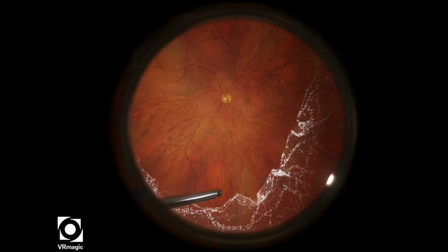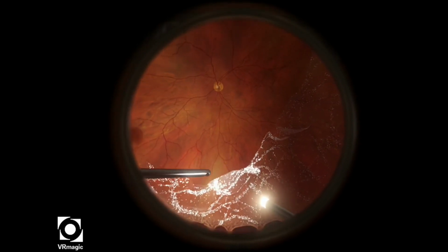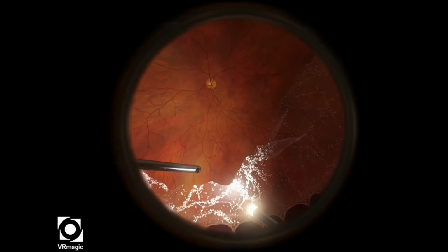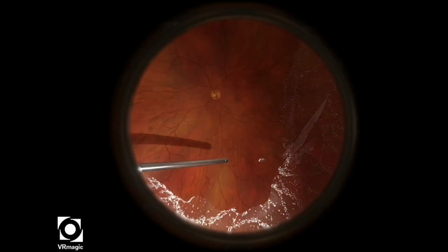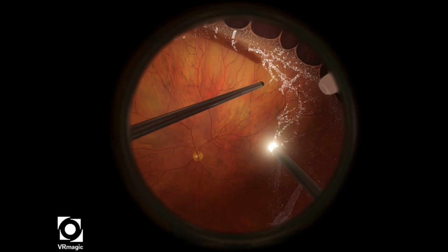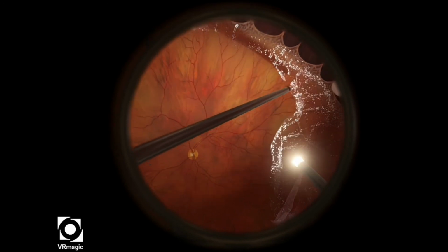And now I switched hands. So again, in the first video that I showed you, I wanted to demonstrate how you could do a close peripheral shave, but then I realized after multiple attempts at this level that the simulator doesn't expect you to remove all the vitreous. It does give you a better score up to a point, but I think if you remove about 90 to 95% of the total vitreous, the simulator will still give you a good score.